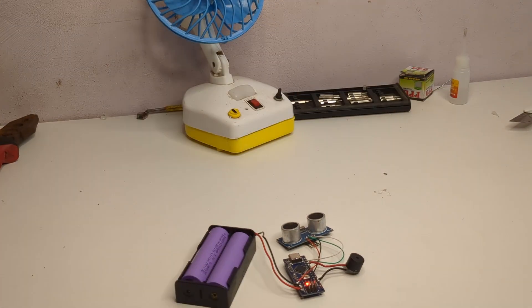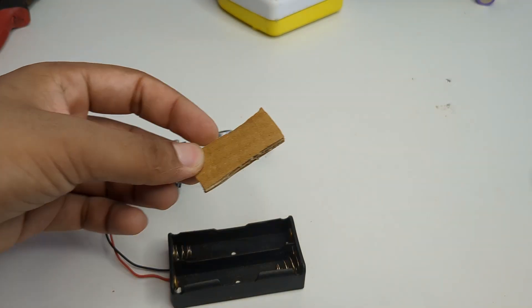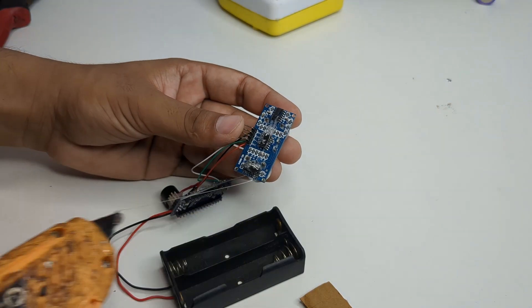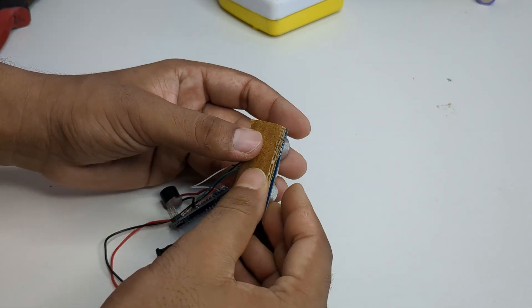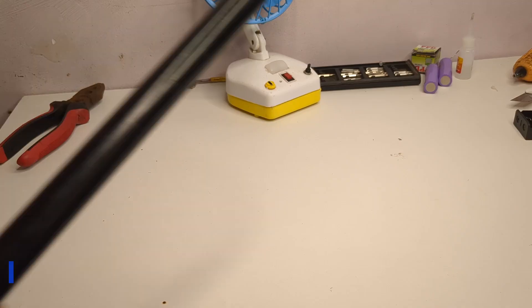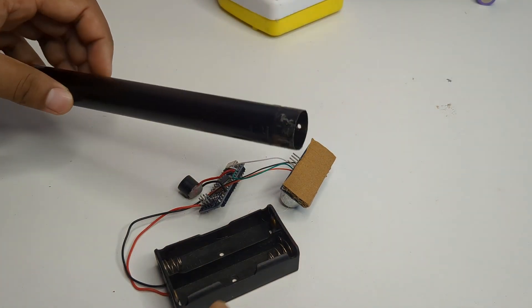Now it was time to fix all the parts onto a stick. For that, I took a small cardboard piece and glued it to the back side of the ultrasonic sensor. Then I took a pipe and started fixing all the components using hard glue.